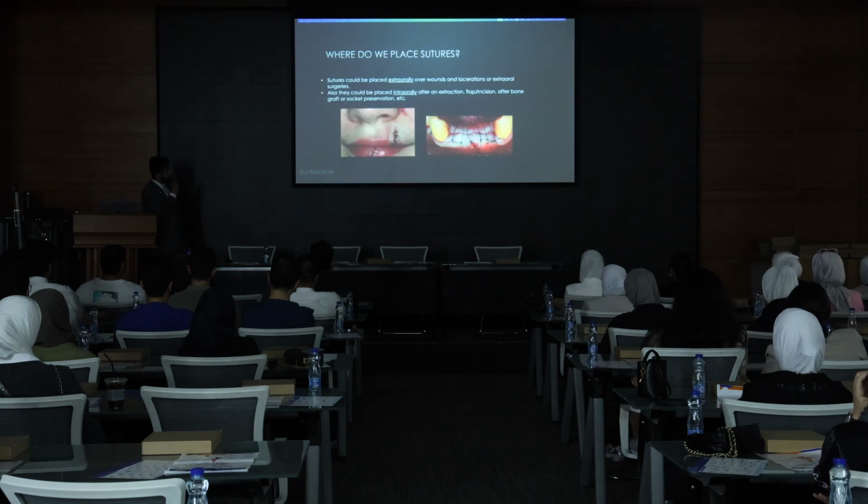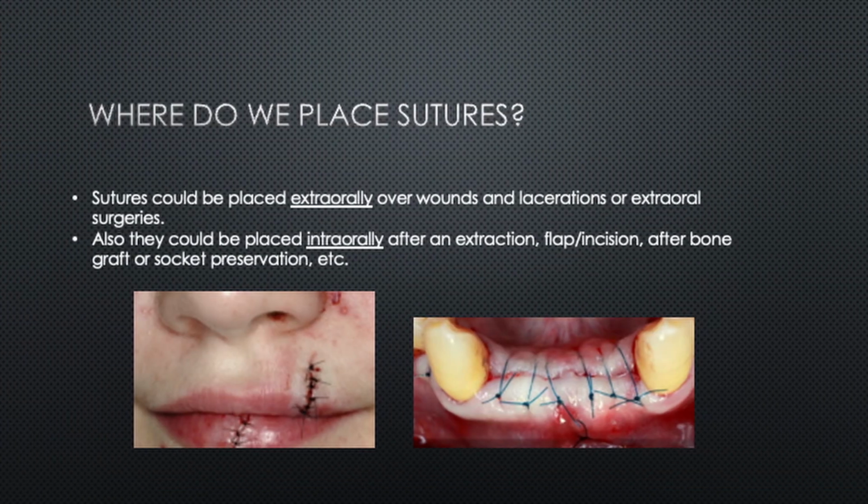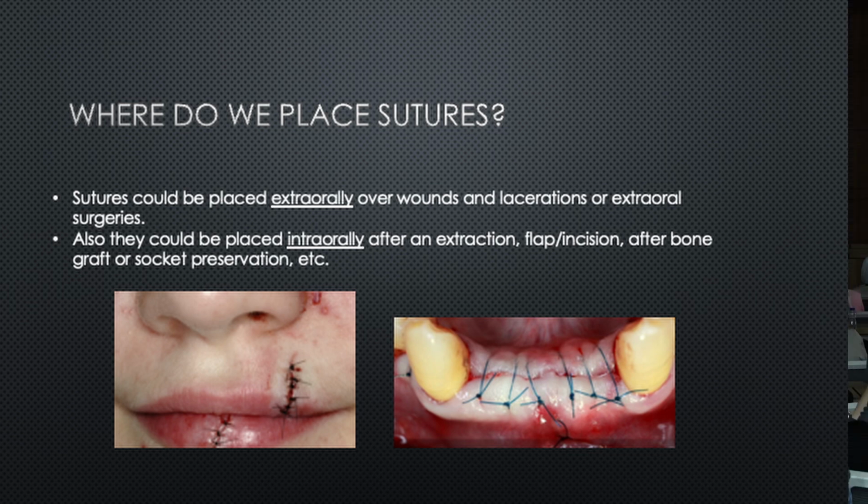So where do we place sutures? Either intraorally or extraorally. In our case, within the dental specialty, when we speak about extraorally, we mean maybe around the lips or in the face or in the neck. Intraorally, of course, whenever we do an extraction or raise a flap or make an incision.